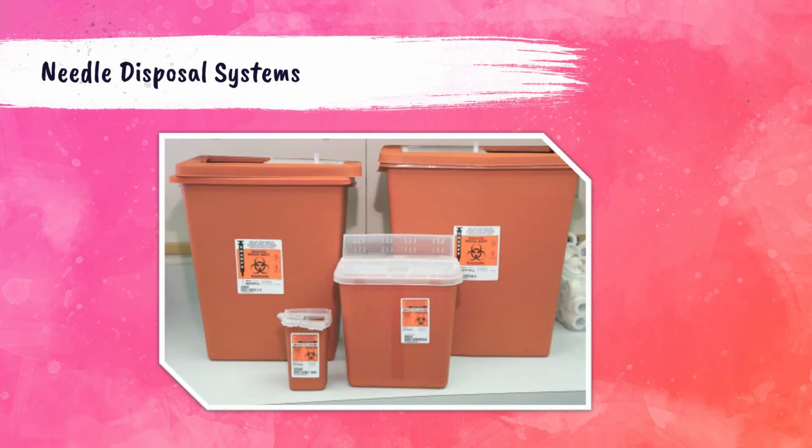And here's a picture of sharps containers. So there's a different variety of sizes of them depending on what facility you work in. They may have bigger ones, they may have smaller ones, but they all serve the same purpose.